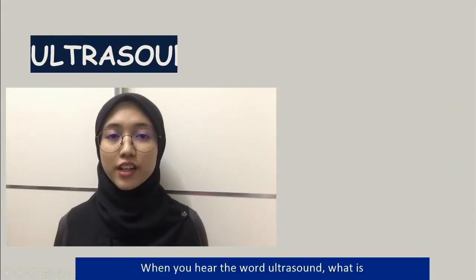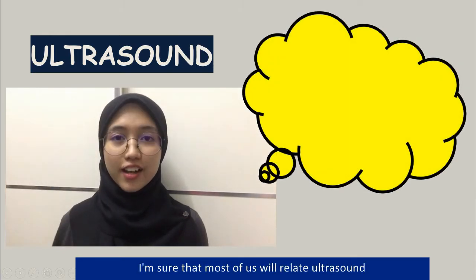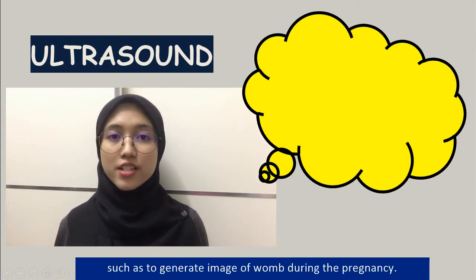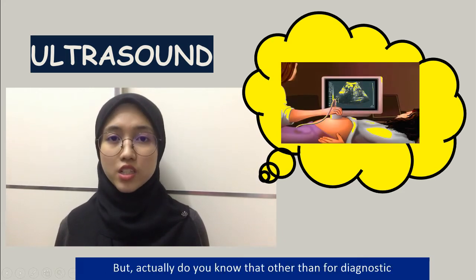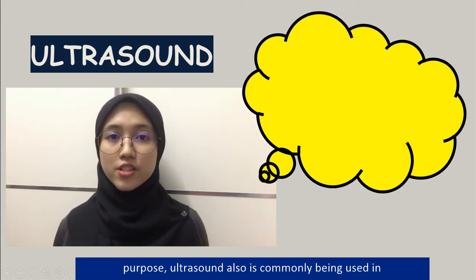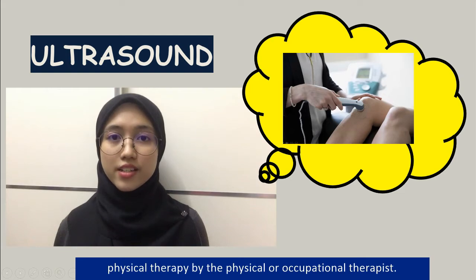When you hear the word ultrasound, what is the first thing that comes to your mind? I'm sure that most of us will relate ultrasound with the one being used to see inside our body, such as to generate an image of the womb during pregnancy. But actually, do you know that other than for diagnostic purposes, ultrasound is also commonly used in physical therapy by physical or occupational therapists?